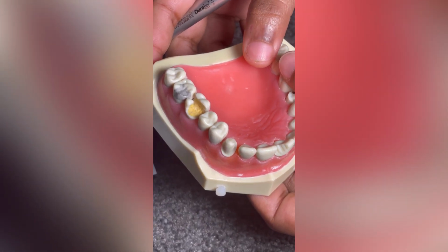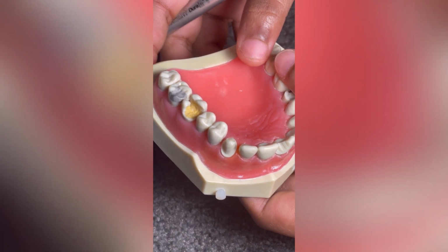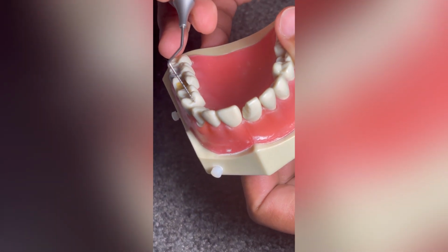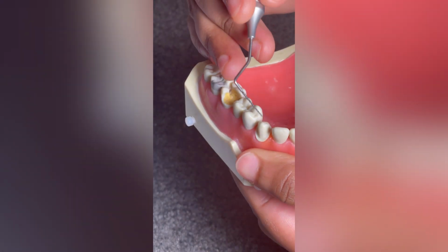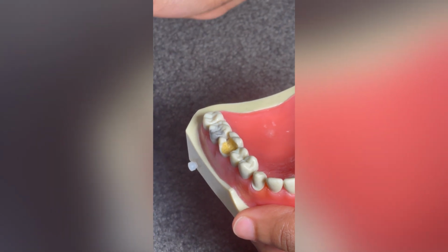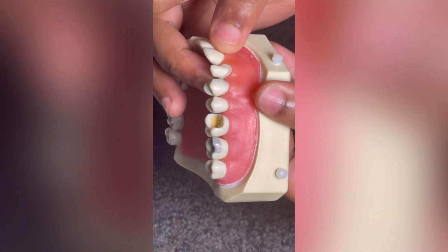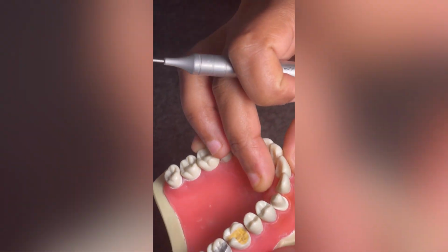Now moving on to the fourth criteria, which is damage to adjacent or assessment tooth beyond preparation. I'm not sure if you can actually see, but there is damage to this adjacent premolar here, but it's not quite evident, or we can just smoothen it. But yes, there is damage, so I would say minor damage to the adjacent tooth. The next one is damage to gingiva. I don't see any damage to gingiva, and that's fine. And debris, there is no debris present, it's nice and clean.